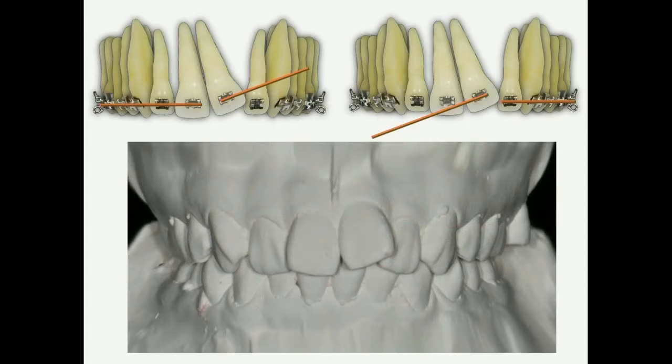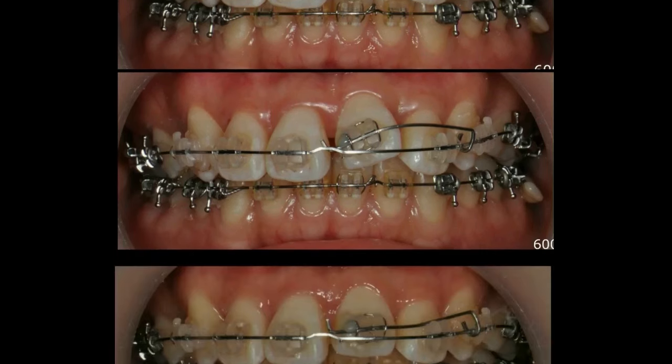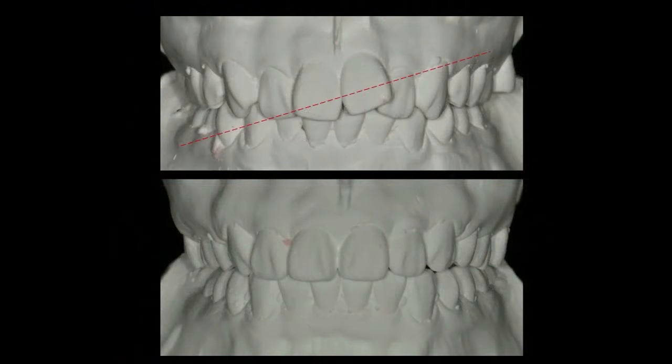Where would you cut the wire for this patient? Yes, cutting the wire between the centrals and distal extension of the wire makes the force system consistent. A cantilever overlay spring was extended distally for consistency. Both clockwise moment and extrusive force are desirable for this patient. Perhaps continuous full arch wire leveling might have produced alteration of the occlusal plane.